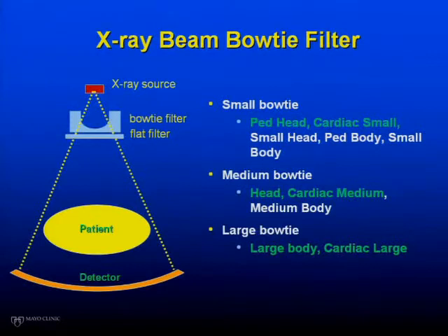Some manufacturers provide several options of the bow-tie for different patient sizes: small, medium, large. It is important to match the bow-tie filter to the patient size.